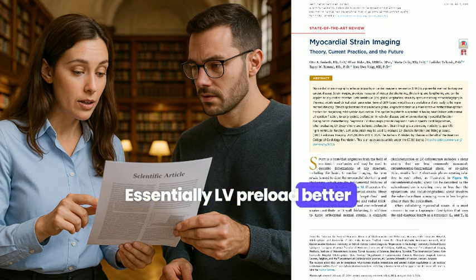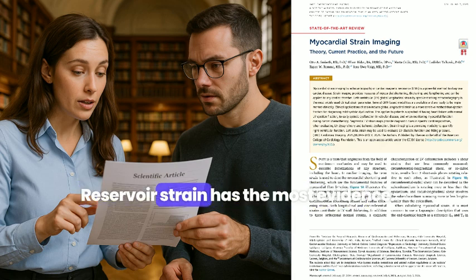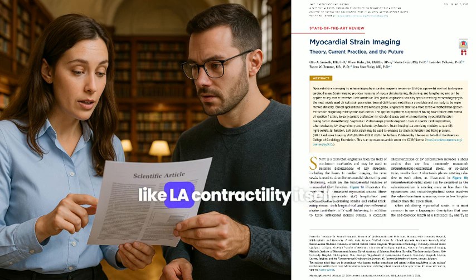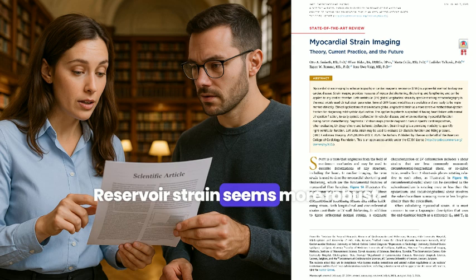essentially LV preload. Better than other LA strain measures. Reservoir strain has the most evidence. LA pump strain also correlates, but is affected by more factors like LA contractility itself. Reservoir strain seems more robust.